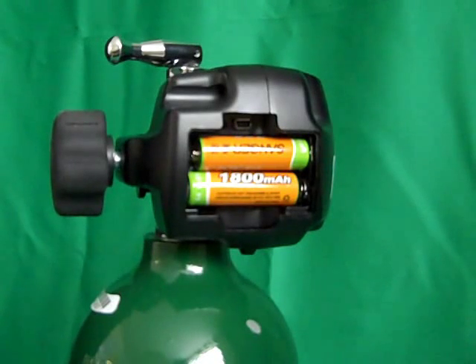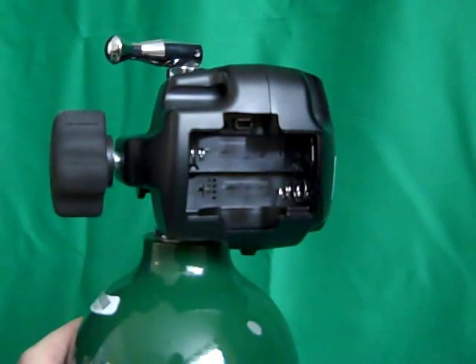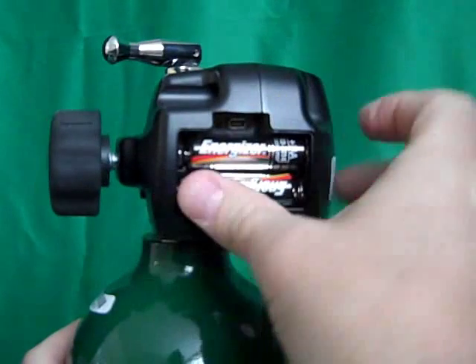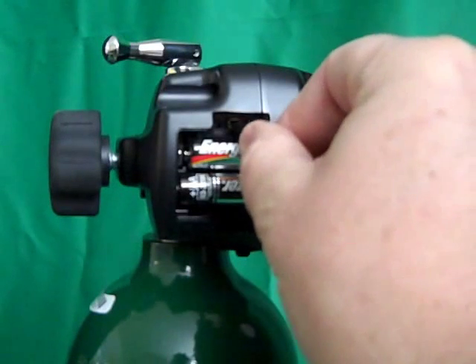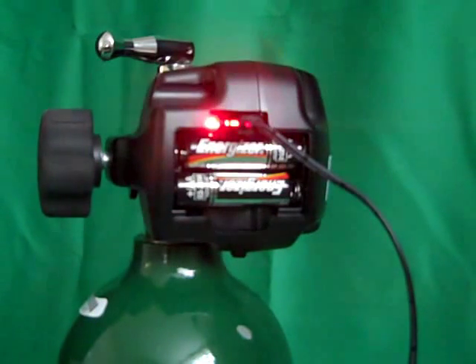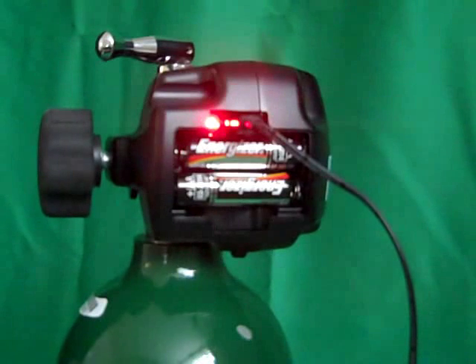If the batteries happen to run out of charge while the user is out, simply remove the rechargeable batteries, saving them for recharging later, and use regular alkaline batteries. Please make note of the polarity of the batteries as you insert them into the unit. Alternatively, you can switch to continuous flow until you can replace or recharge the batteries. Note that if you forget to replace the non-rechargeable batteries and plug in the charger while alkaline batteries are still in the unit, the red indicator light will flash, indicating a problem. Remember that the red light is solid on for charging, off when the batteries are fully charged, and flashes when there's a problem or the wrong type of batteries are installed.